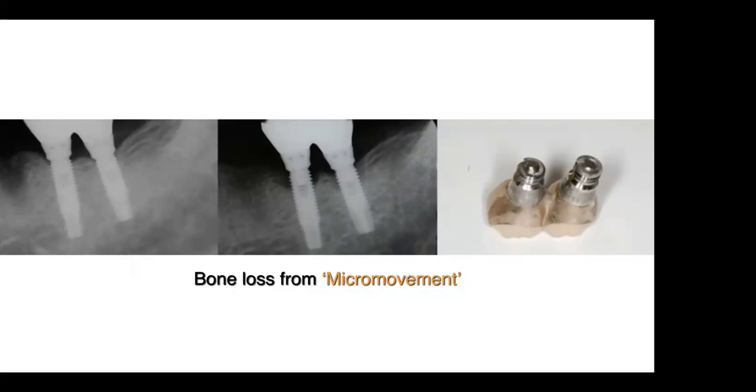What you can see in these implant fracture cases, quite often we see some bone loss around the implant that's probably caused by the screw loosening or the inflammation at the abutment and implant interface, which will cause the bone loss, and the level of the bone remaining can act as a fulcrum point, which again can cause the fracture of the implant itself.